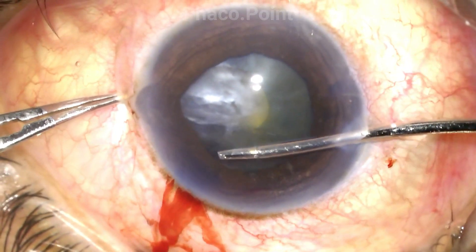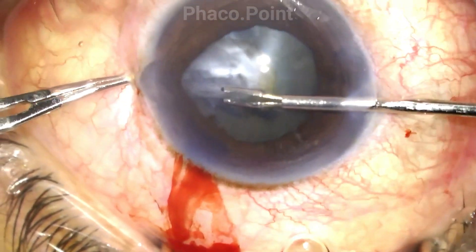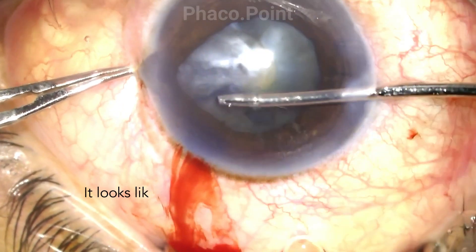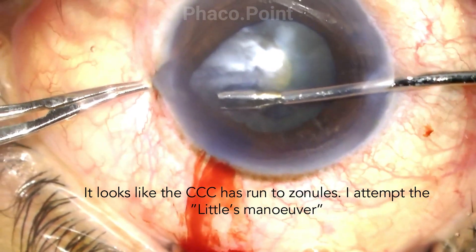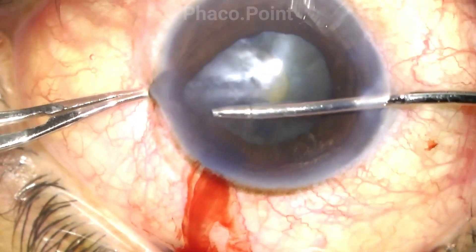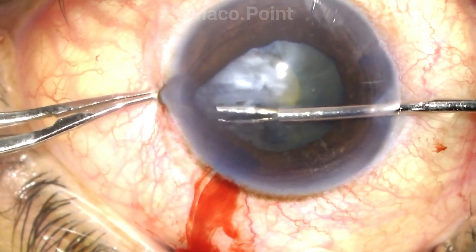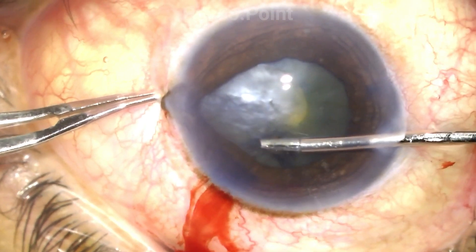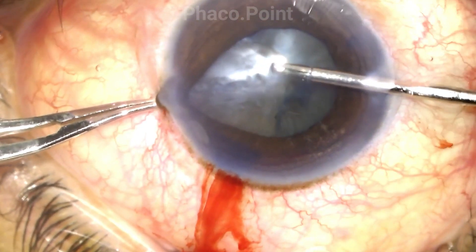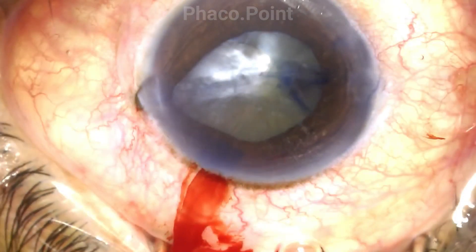This first attempt seems unsuccessful because I'm unable to enlarge this tear. With the first attempt, I find a significant amount of resistance. I try and grasp the edge of the capsule slightly closer, and once having held it, without letting go, I firmly pull the capsule and I can feel the tear actually happening. I'm able to turn the tear around and create a capsular rhexis. It's quite possible that it's gone pretty much out to the equator and got back in, but it doesn't matter — it's still going to remain a stable capsular bag.